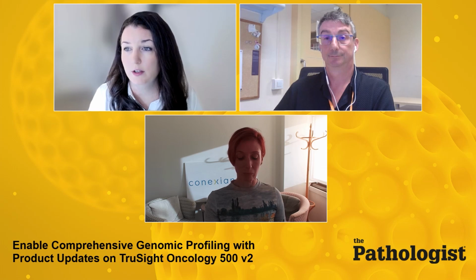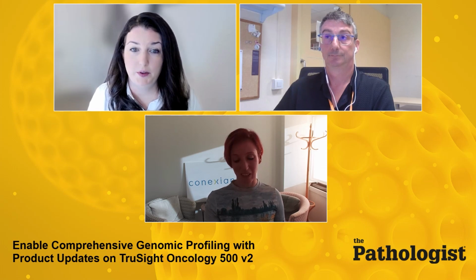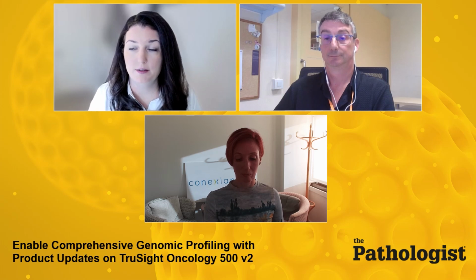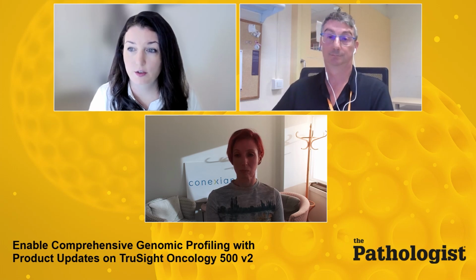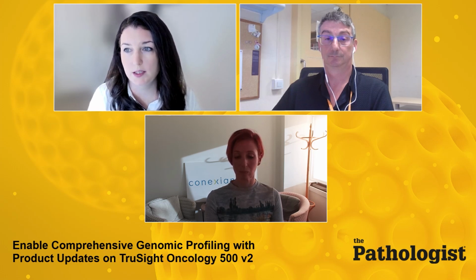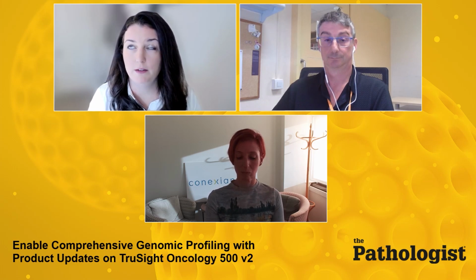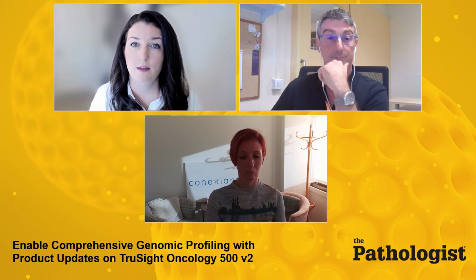Helen, there's also a question about analysis software that I could speak to. So the analysis software for the TSO 500 V2 product, the first analysis app that will be compatible is DRAGEN TSO 500 2.6.2. And the question is whether the output of that analysis is the same for the V2 assay as the V1 assay. And yes, it is the same output. The only difference in the software is that there is a signal to noise baseline file that is specific to the V2 assay.